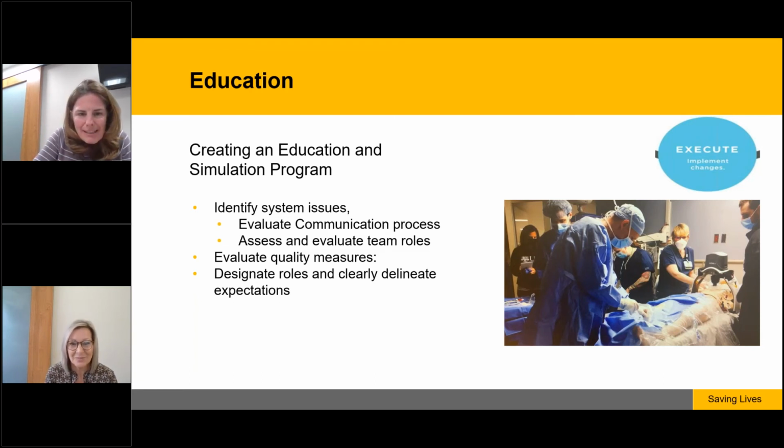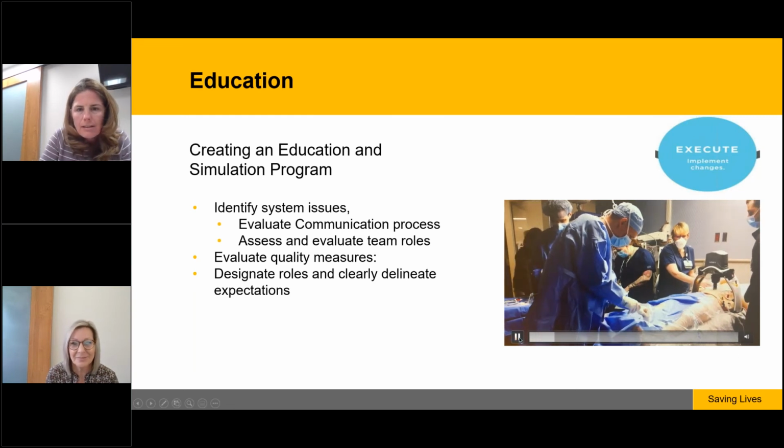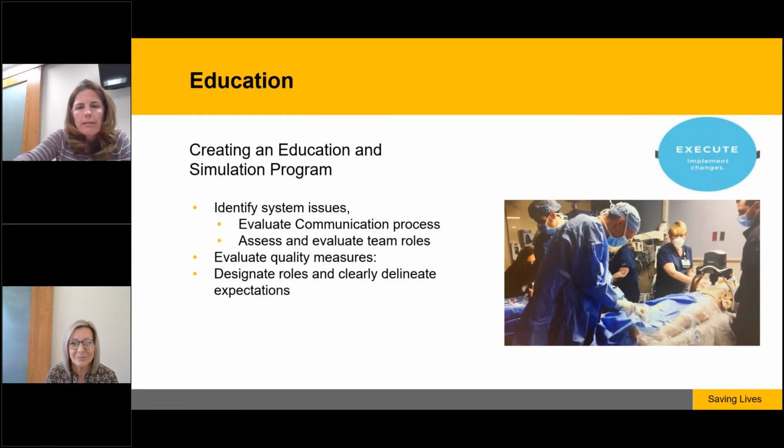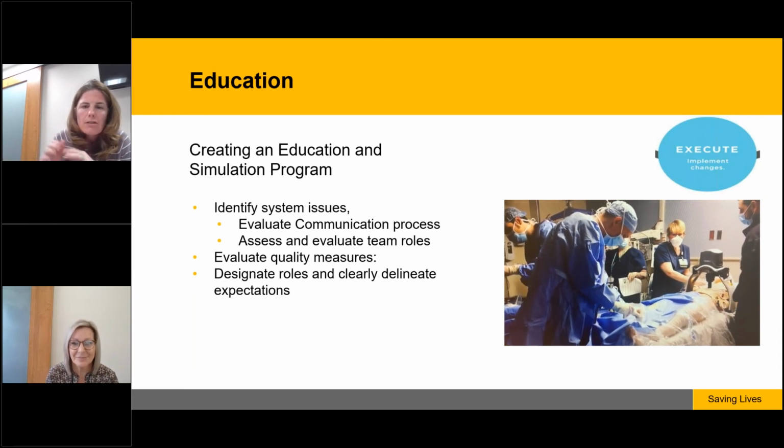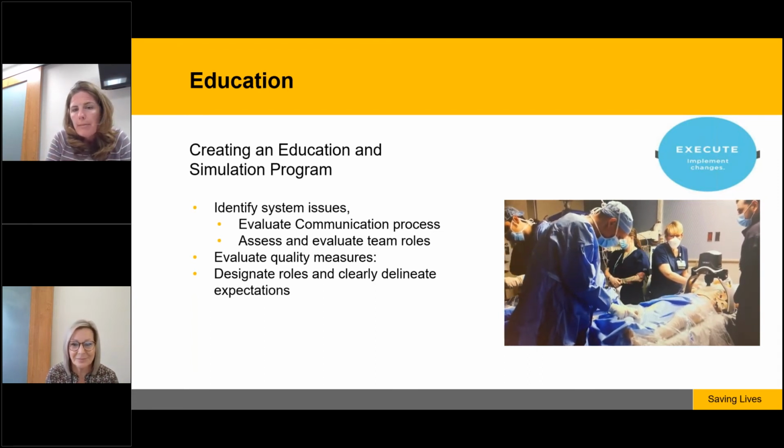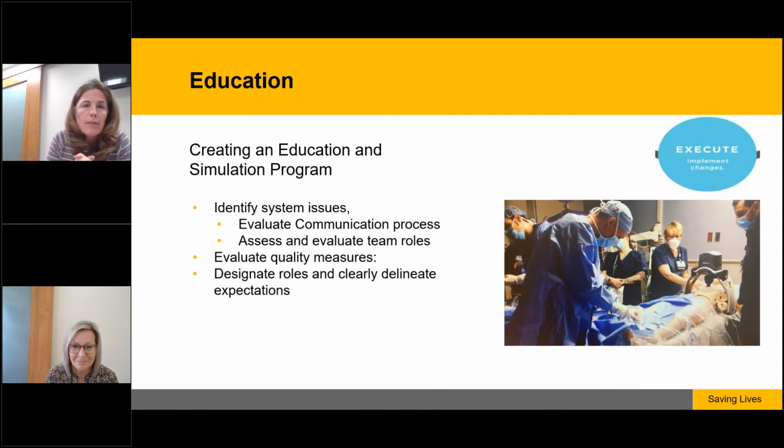And then I'm just going to play this little video so it gives you a snapshot of what our simulation looks like. As you can see, the mechanical CPR device is going. Our bedside nurse is standing next to that, also giving meds. Our APP number 1 is up at the head of the bed next to the respiratory therapist, who's bag valve masking the patient. We have our 2 cardiac fellows up front here. They're cannulating to go on ECMO. And then our acute shock resource nurse is right behind them with a sterile cart, allowing them to get all of their supplies and assisting them.